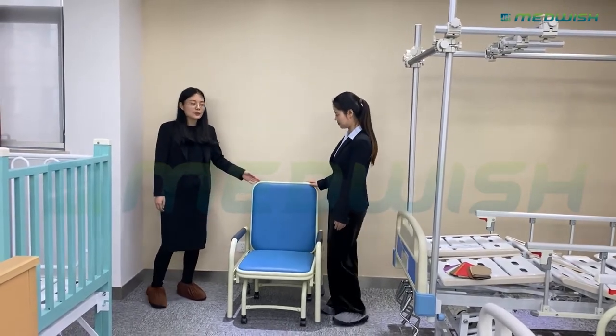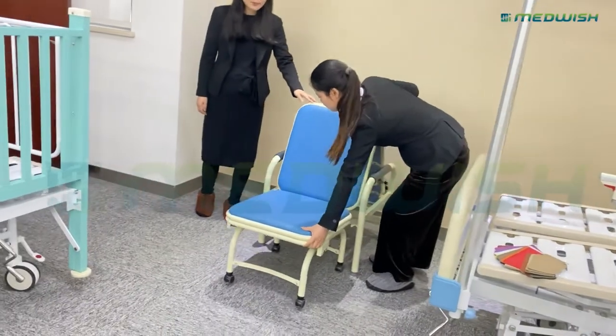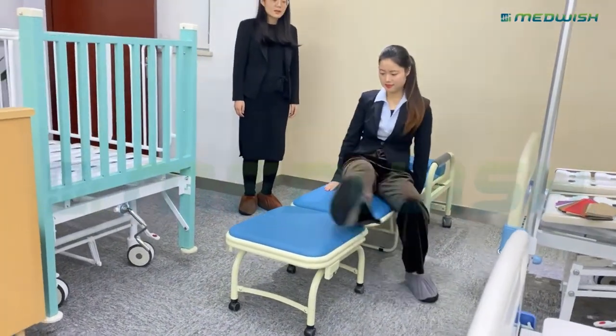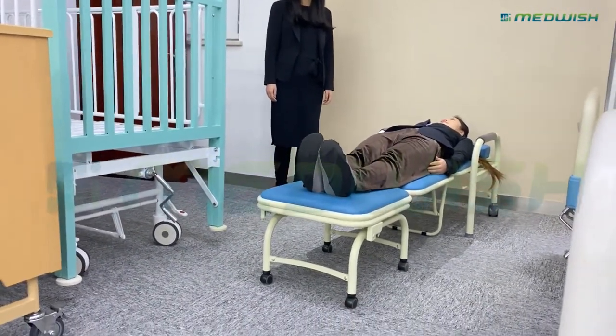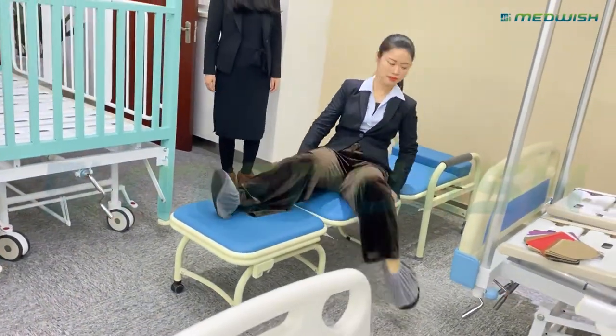Let us see how to operate it. We can push the chair to the back position very easily. The whole chair is covered with a PU mattress, which is waterproof, and when people lie on it, it will be very comfortable.